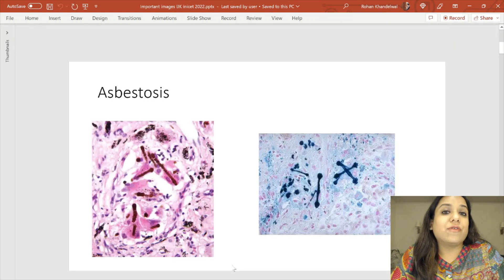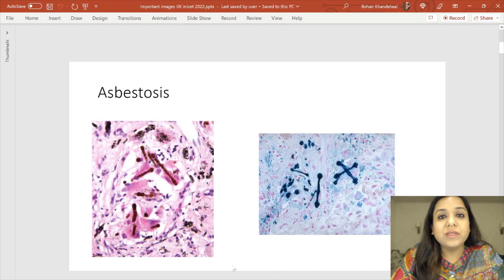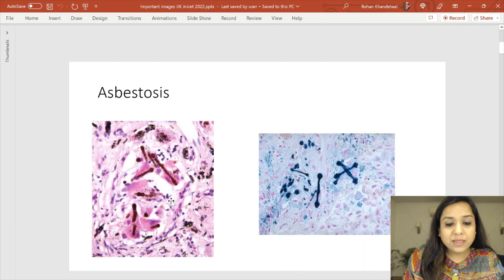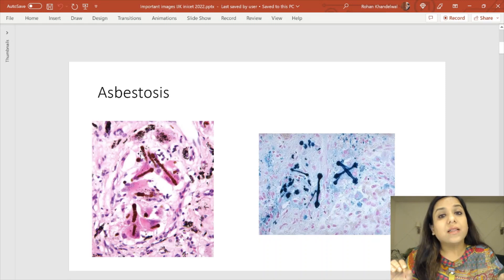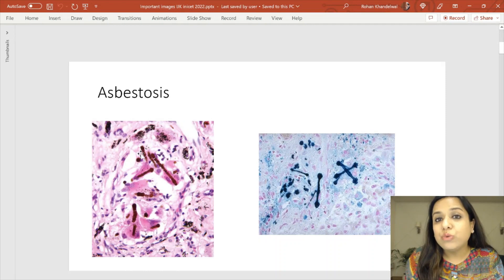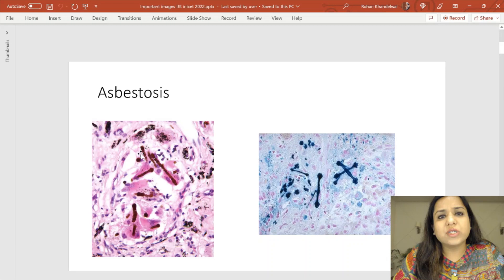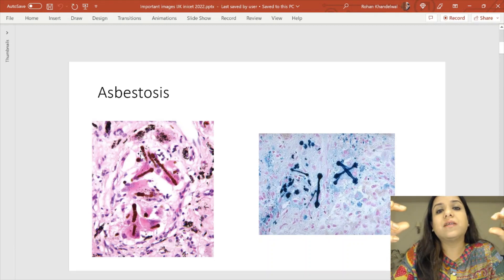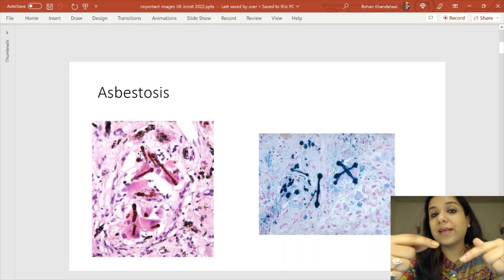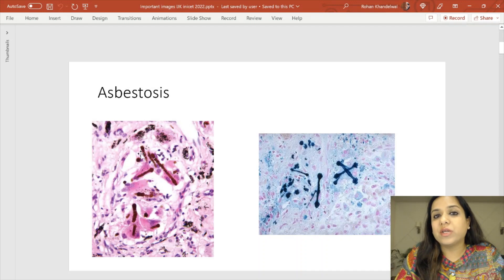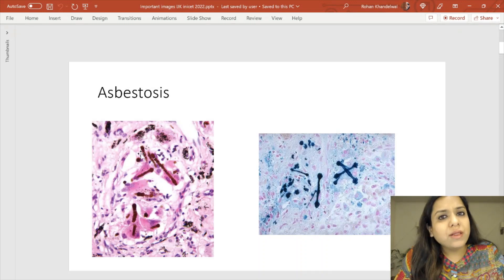The first image is that of ASBESTOSIS, which has been asked multiple times. This is a biopsy from the lung or the pleura. You can see these brownish beaded rod-like structures — these are the ferruginous bodies or ASBESTOS bodies. They are asbestos fibers coated with iron, and because of the iron coating, these bodies will be Prussian blue positive.